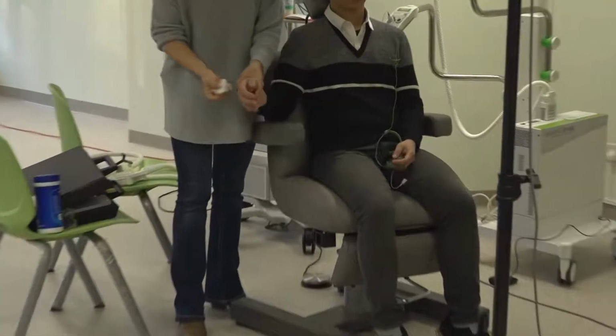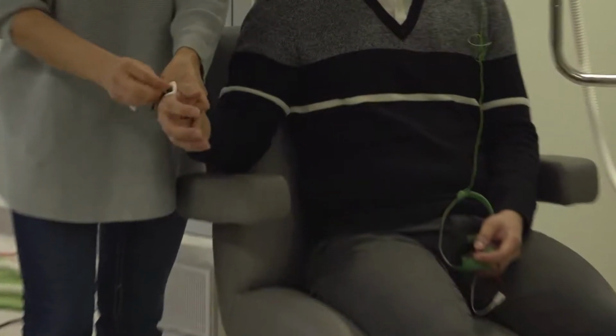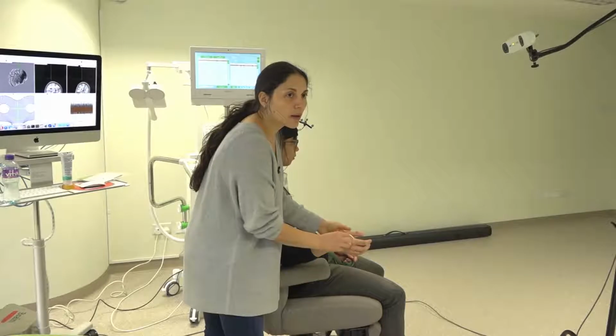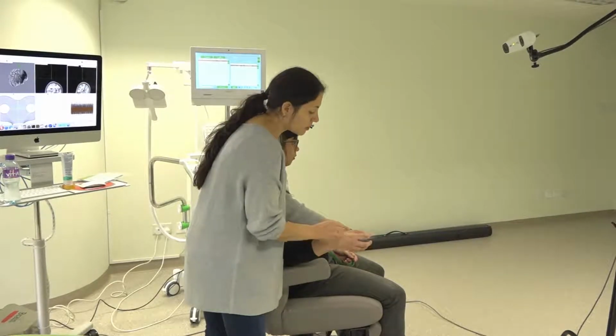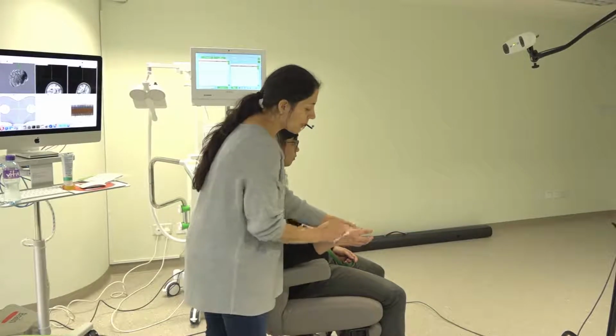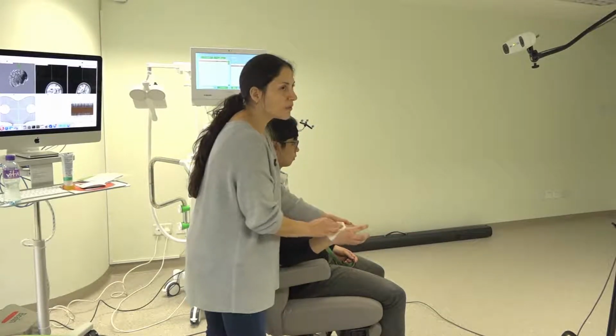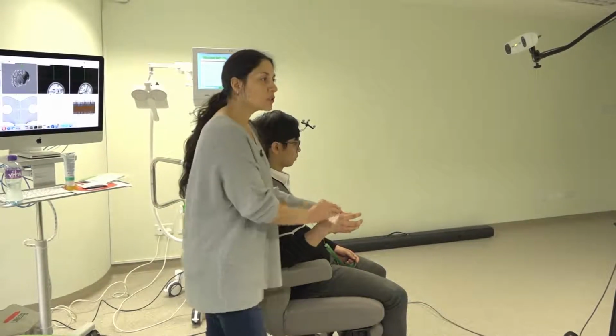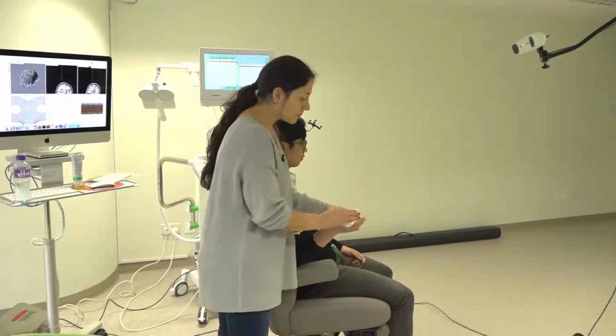And I'm gonna clean his area, right? I will use alcohol. I prefer alcohol and a cotton or something. Probably here you will not have that problem, but I have had this problem with other EMG that you just don't see the image. It's so noisy, then what you need to do is to clean better the area.